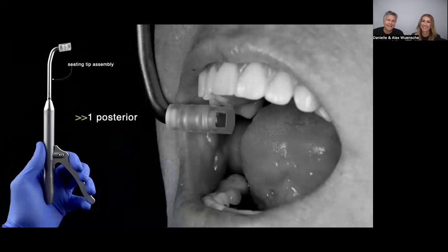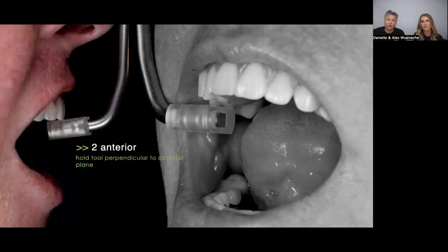So here you see how a hybrid will get inserted in the patient's mouth. You see that handle where you can actually click it, and you touch the teeth on certain areas where the implants are, and you click it, and that will actually push that hybrid with 1 click onto the implant. You go across the arch with that until the hybrid is seating very stable and very strong. And you do the same thing when you remove it.